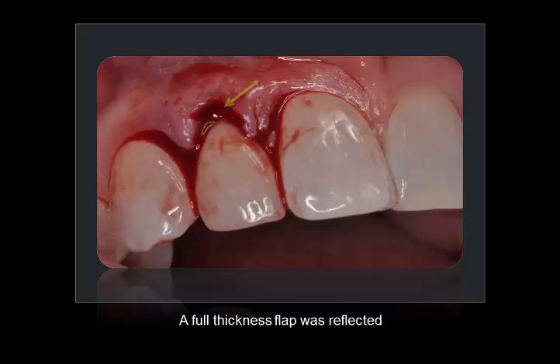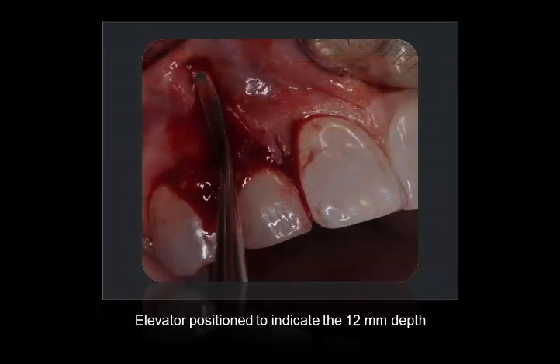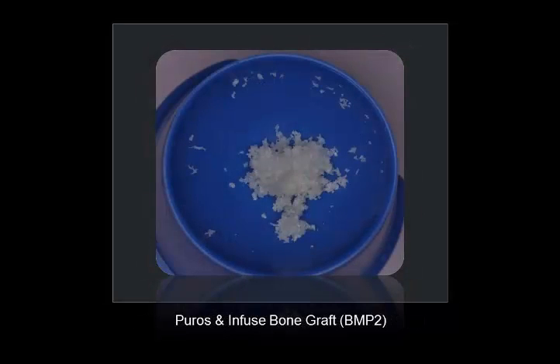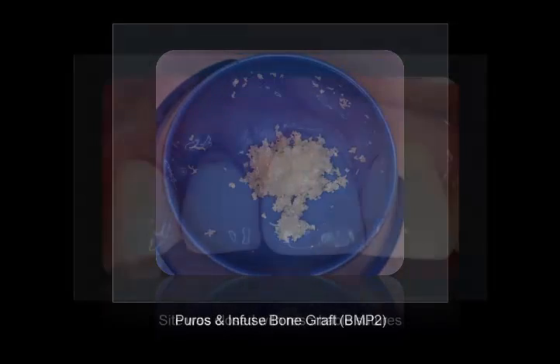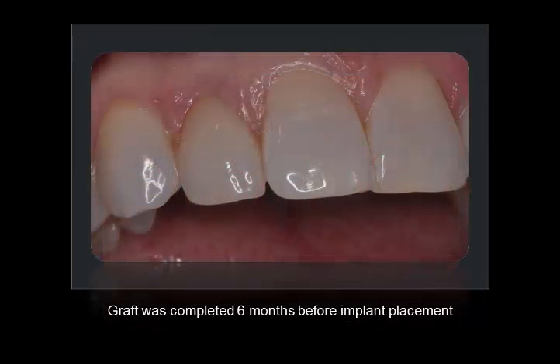An intrasulcular incision is made and a full thickness flap was reflected. A full thickness flap was reflected to a depth of 12 mm for the placement of the bone graft. The buccal concavity was grafted with 50 micrograms of BMP2 and Puros. The patient was from out of state, so the site was closed with resorbable sutures. The site was allowed to heal for 6 months prior to implant placement.